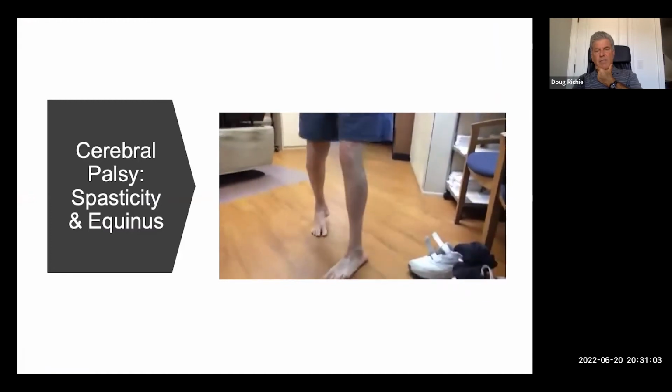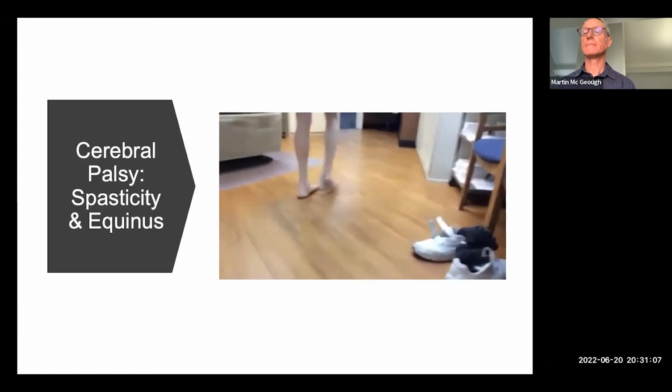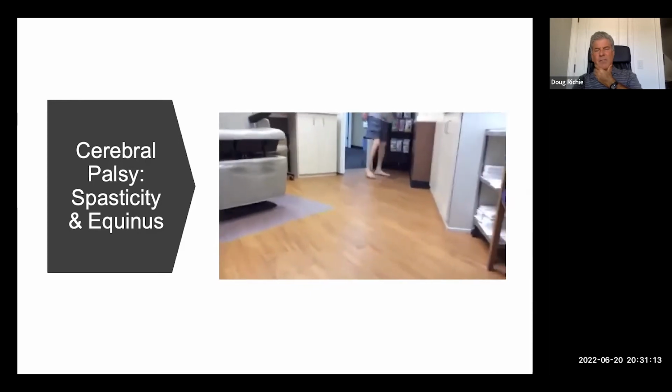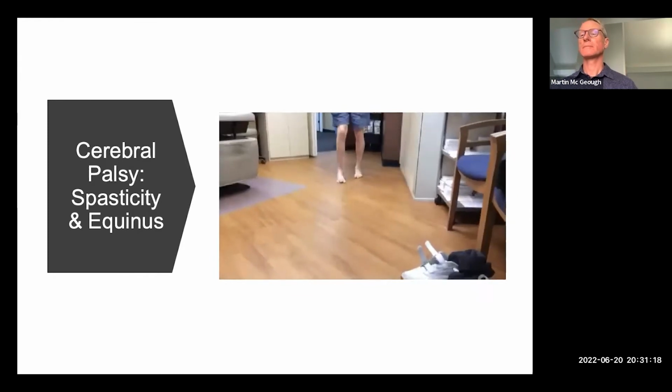Cerebral palsy can be very challenging to treat. Look at that right side with the varus instability. But if I'm going to use a brace, I'm going to use the stability of the restricted hinge because I want to try to control his spasticity and contracture.